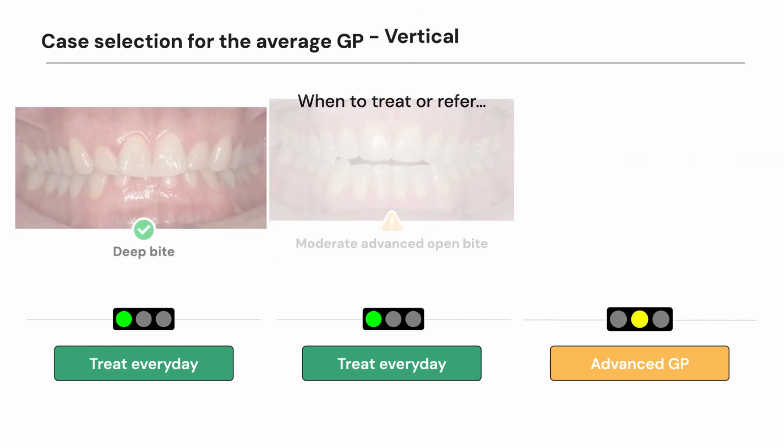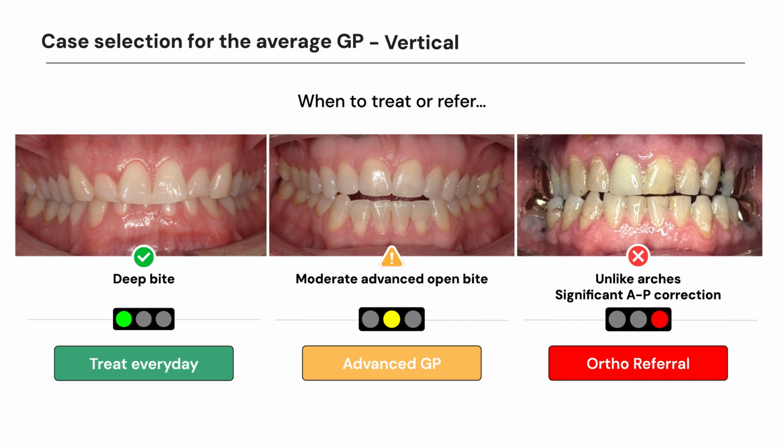Okay, let's talk about vertical now. Well, that's the up and down, right? What about this one? I see that there's, oh boy, that's about 85% on that one too, 90% on the other one. Man, that's a lot. Okay, can I get those teeth down 2 millimeters in each arch and end up with something that'd be better? Sure, that's a Monday morning case for us. We can help line that up and get that looking much better, to get those teeth fitted together properly and manage that bite. Something I'm happy to do.